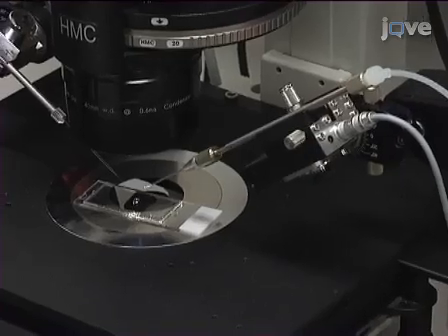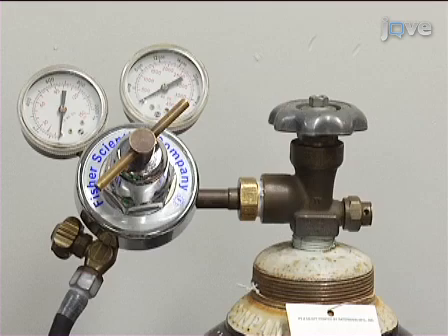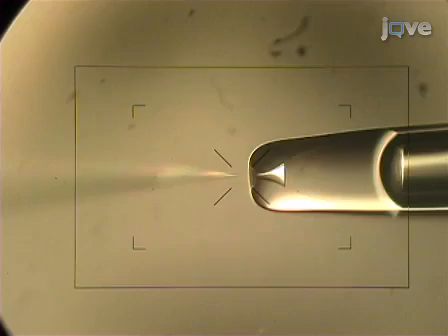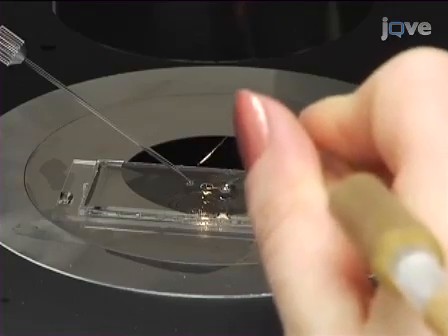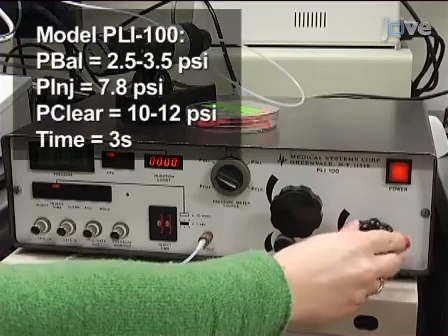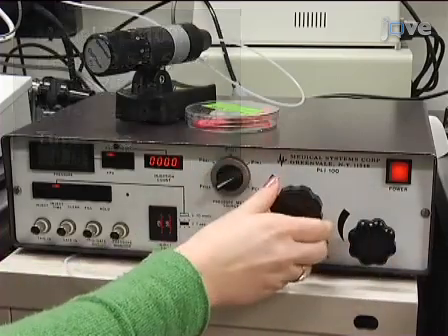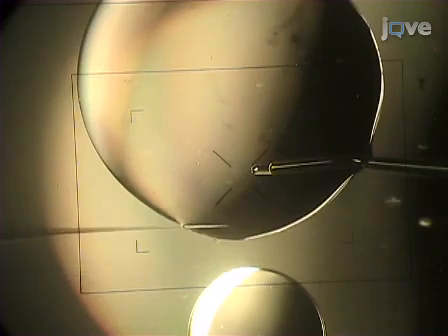Place injection and holding pipettes into the holders and position into the drop of collection medium. Turn on the nitrogen tanks that are connected to the pico-injector and anti-vibration table. Open the tip of the injection pipette by gently tapping it against the holding pipette while filling it with medium. Transfer 5 to 10 oocytes from the incubator to the collection medium drop on the platform. Now, set the parameters of the pico-injector for an injection volume of 5 to 10 picoliters. While pressing clear, move the injection needle to the material drop and fill. Return it to the medium drop.